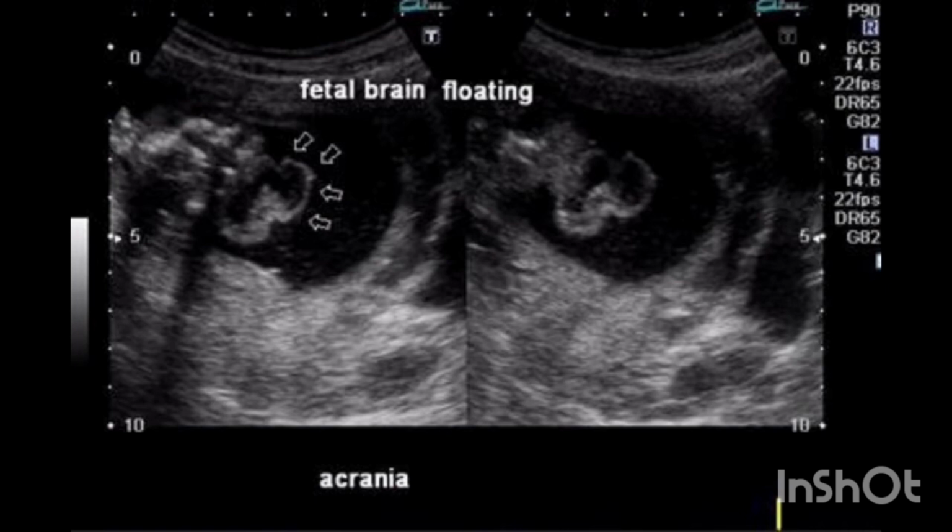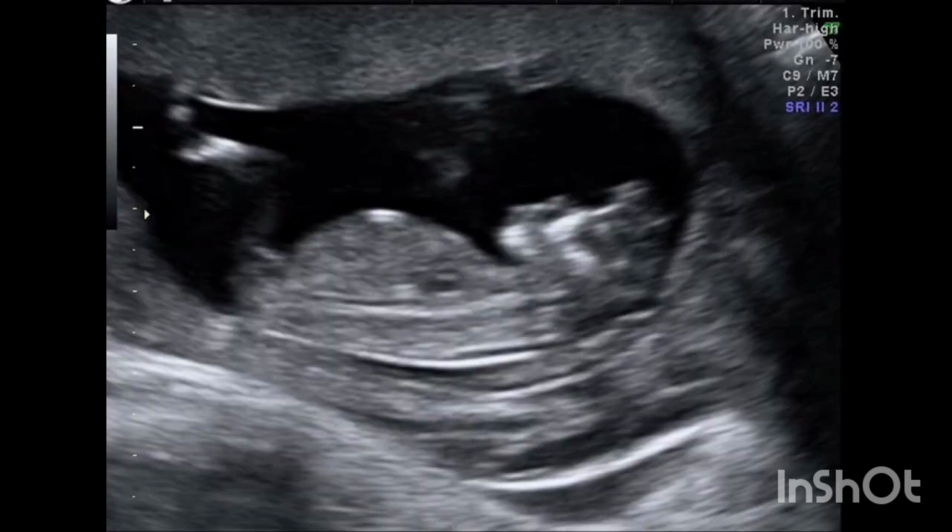The fetus is said to have acrania if it meets the following criteria. The fetus should have a perfectly normal facial bone, a normal cervical column, but without the fetal skull, and a volume of brain tissue equivalent to at least 1/3 of the normal brain size. There are no known family ties in acrania, and recurrence rates are extremely low.